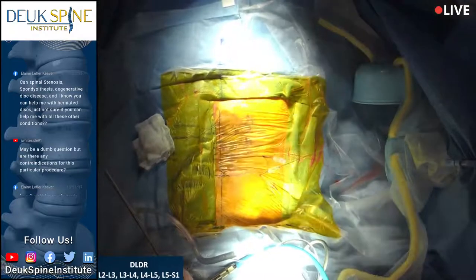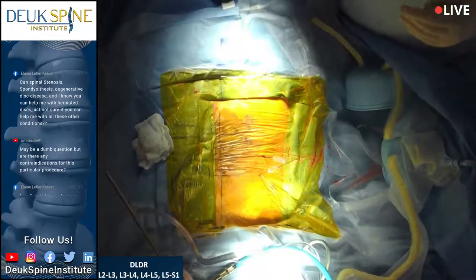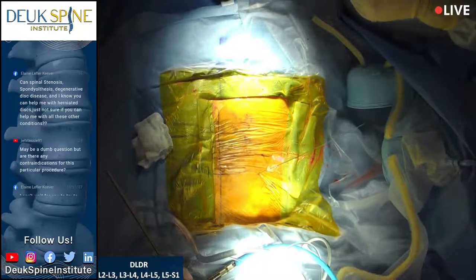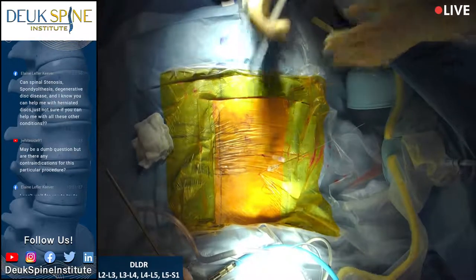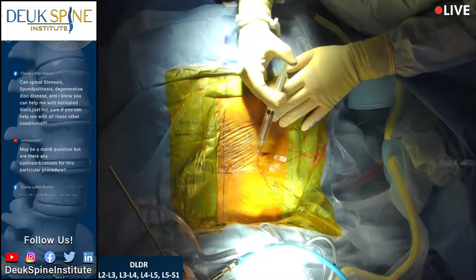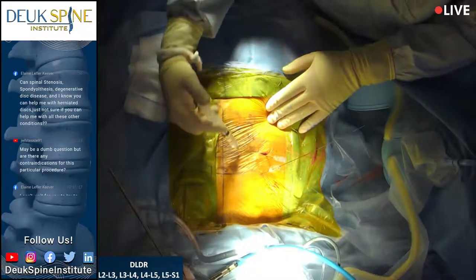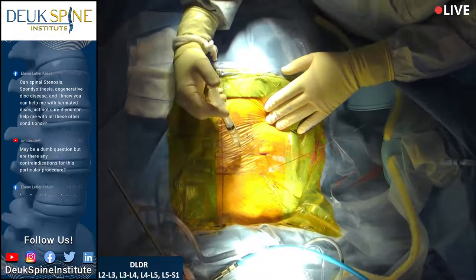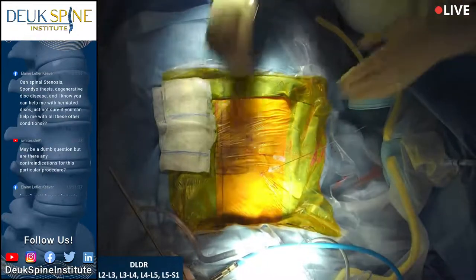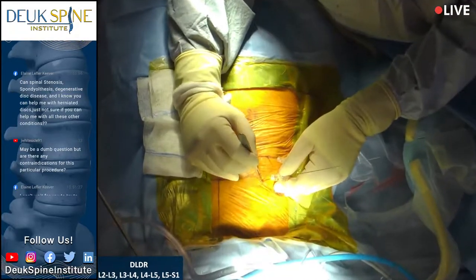All right. So here we go. We're gonna jump over to L2-3. And I'm going to numb the skin up some more. Anesthesiologists like when we use numbing medicine. And the reason is that if you're gonna make an incision, there's a lot of pain fibers under the skin. So if you numb them up, then the patient won't feel as much. So they don't have to give as much anesthetic, which is safer for the patient. Okay, we're gonna start at L2-3 now. And then we're gonna finish at L5-S1.